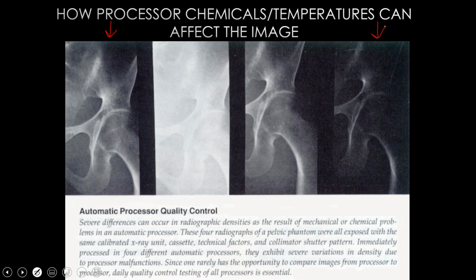It's too dark. So again, as the last part of this blurb says, daily quality control is essential in order to have good diagnostic quality imaging.